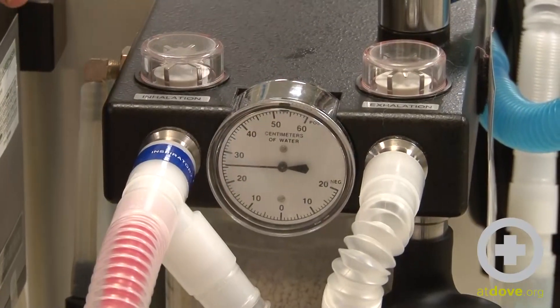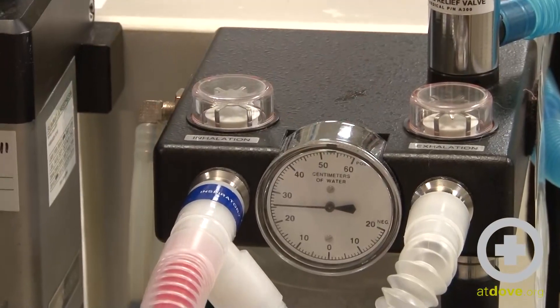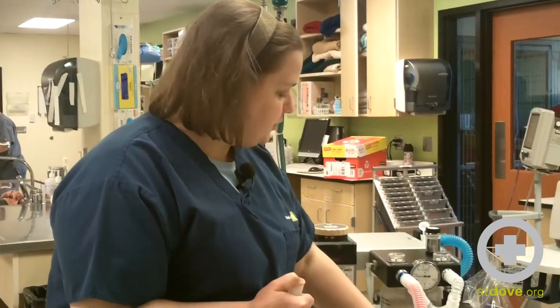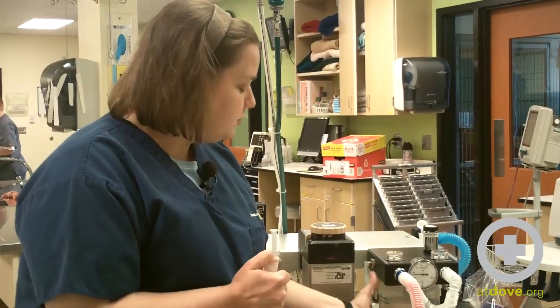You want to make sure that this manometer is not going to drop more than one centimeter of water per second. If that happens, you've got a leak somewhere in your system. Check your hosing, check your reservoir bag, check your CO2 granules. Make sure everything's screwed in correctly.